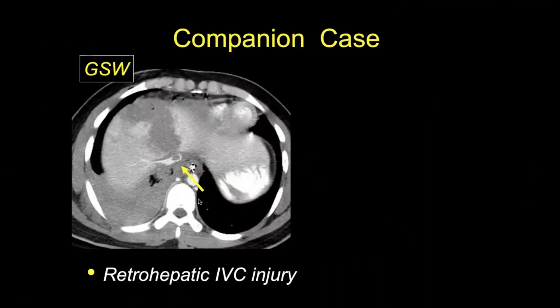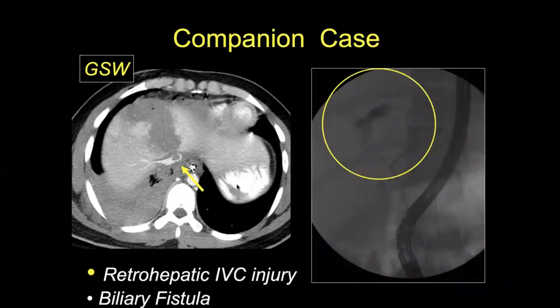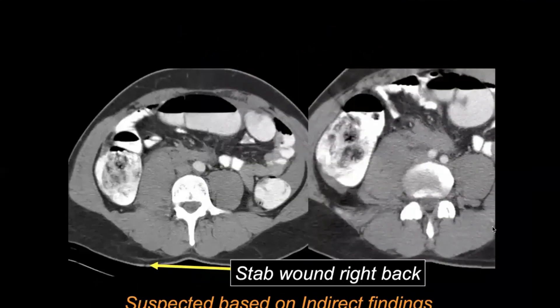Companion case: a patient who sustained a gunshot wound to the right thoracoabdominal region. Note the IVC injury with irregularity in the retrohepatic IVC, which has a significantly worse prognosis than other injuries. The patient also had a biliary fistula.